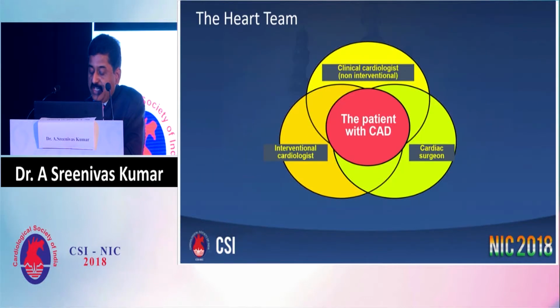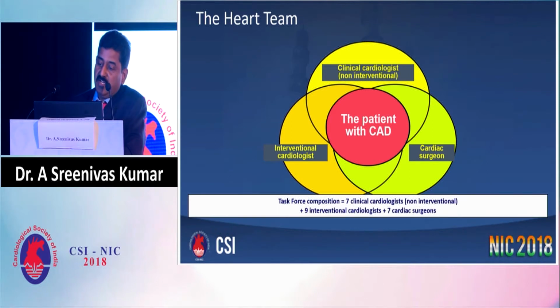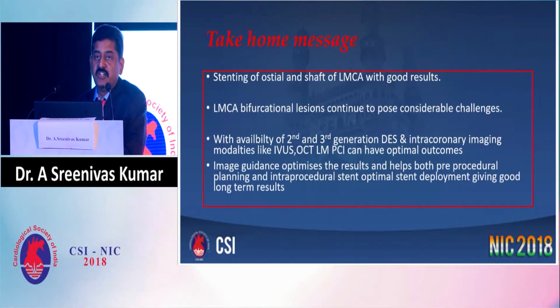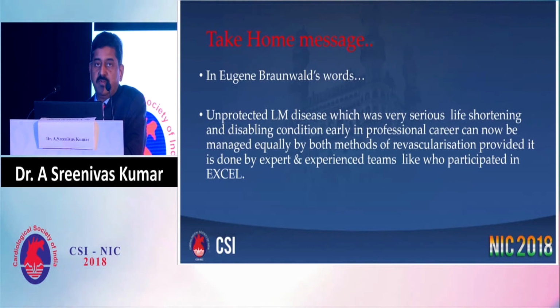We deal with the patients first, but always a heart team approach, really thinking about what is good for the patient and doing right for the patient is important. In today's era, whenever bifurcations involve higher SYNTAX scores, it's more and more imperative to involve the surgeon in discussion, and with latest generation stents with imaging guidance, we could now offer these patients this therapy as a treatment of choice.